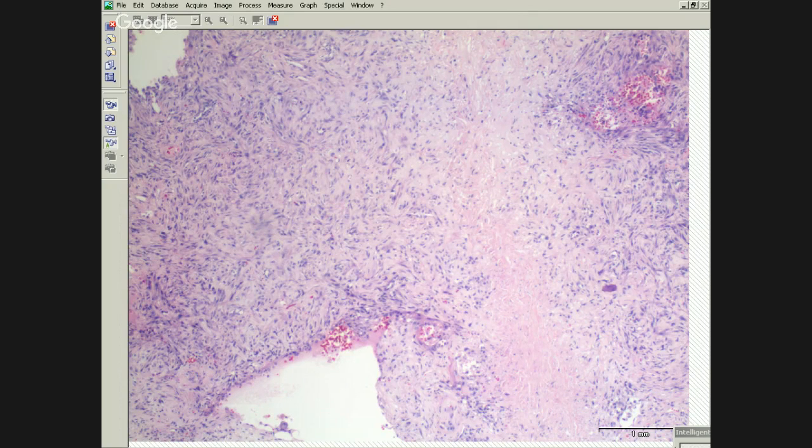Now, your other stains that you typically get for your mesothelioma differential diagnosis for the epithelioid type don't apply here so much. So you get cases sent in all the time that have like CEA and B72.3 and things like that done on them, but that's not really applicable here. Your mesothelioma markers can still be used.